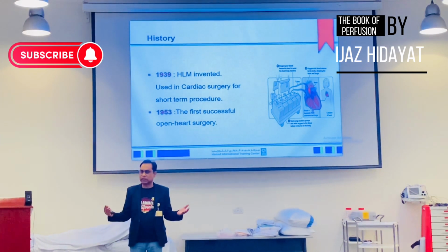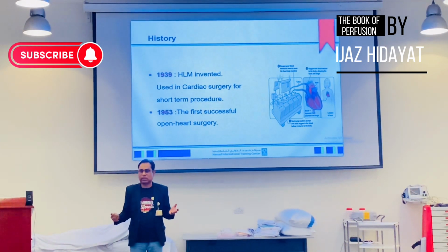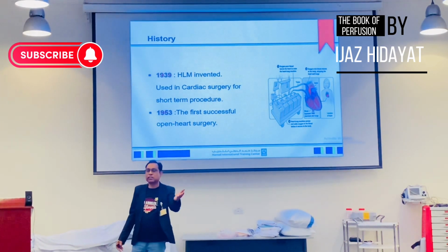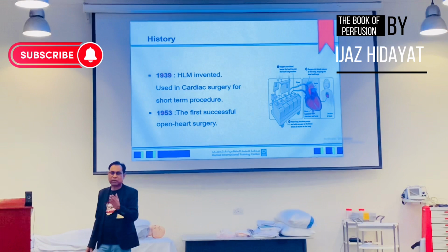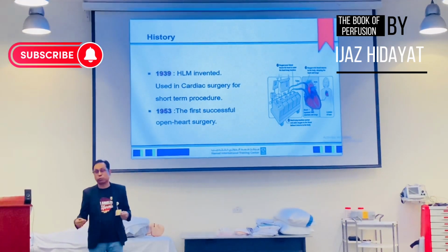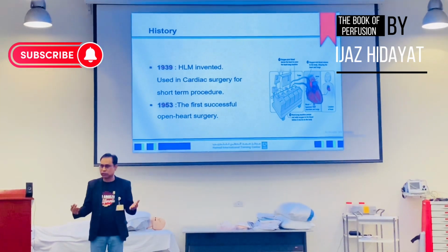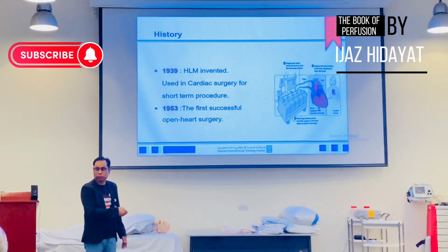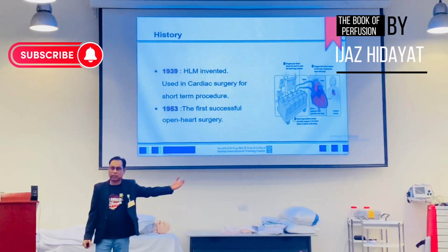If there is an ECMO activation, your team will go there, just like the CPR team we have in the beginning. Similarly now we have the ECPR team. So wherever there is an ECMO indication, we can go and cannulate, and it's a portable, user-friendly machine. If you think of before, it was a huge machine. It was not possible to move from one place to another.